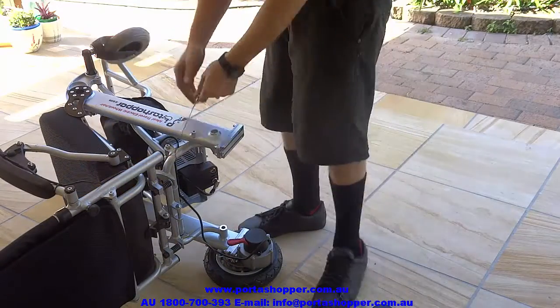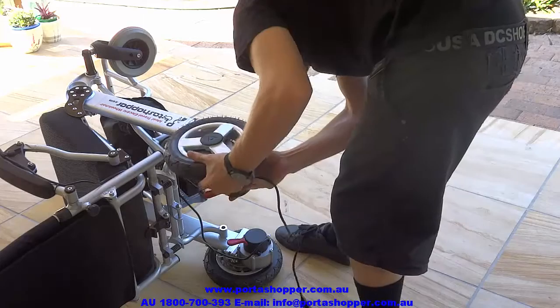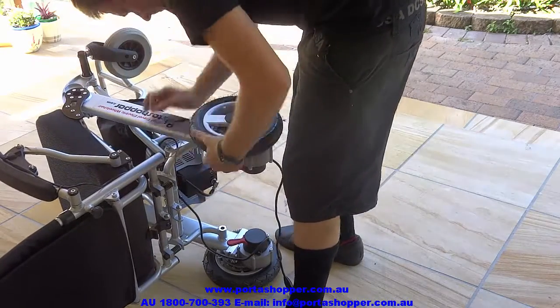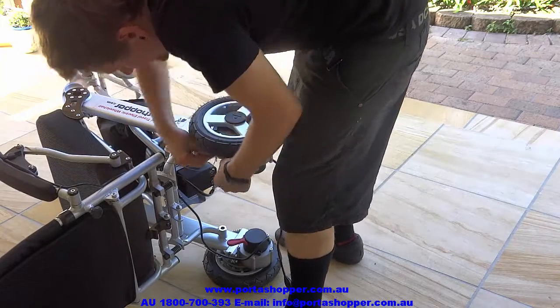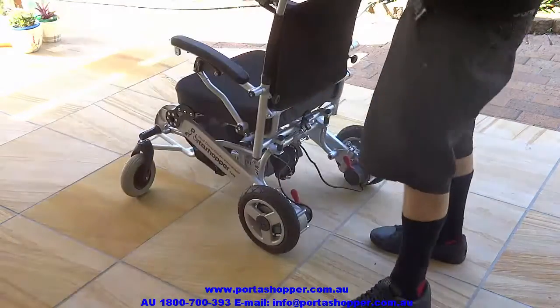You simply slide the wheels off and unplug them. And to assemble it again, simply slide the wheels back on, push the safety pin in, and plug the wheel back into the control unit. And it's as simple as that.